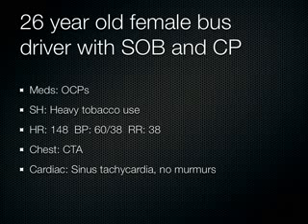Normally, you've got the left ventricle and you've got the right ventricle. The right ventricle is about two-thirds the size of the left ventricle, correct? You with me? So, what happens during a massive pulmonary embolism to cause this derangement of vital signs? The right heart gets bigger than the left heart. So, if I had a patient who's unstable and I thought they had a PE, and I couldn't get a CAT scan to confirm it before I pushed thrombolytics, because thrombolytics are indicated in shock, okay?